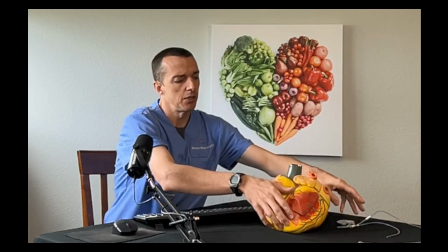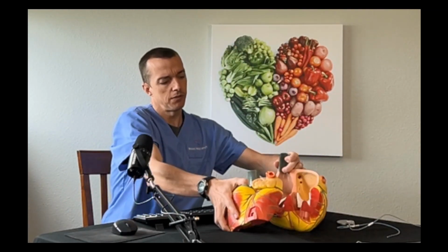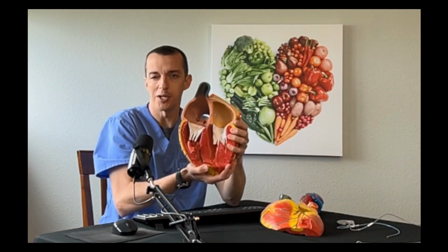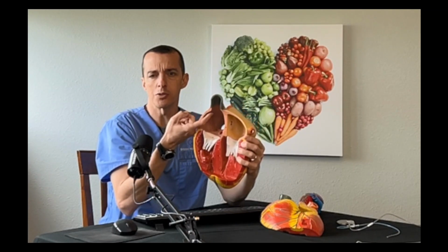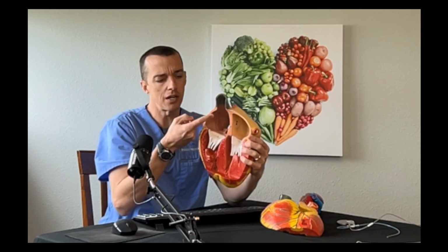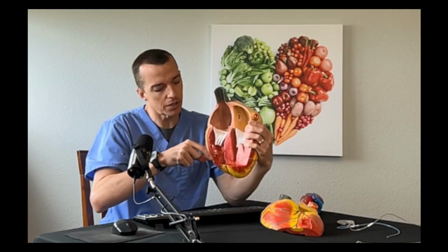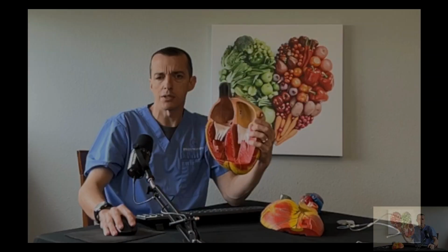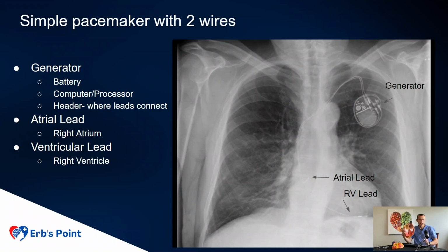Again, just to use it a little slightly different for some people, if you need to visualize it this way. Here is a gigantic heart, but we'll go with it here. And so this is your right atrium, and so you'll have a wire kind of stuck in there. And then this dual chamber pacemaker, you'll have a wire stuck down here in the right ventricle of your heart. So I'm going to go back to our x-ray here. And so we've got a wire J'd up right up here in the right atrium, and then we've got a wire down here in the right ventricle. Okay? So that's what's happened to you. Hopefully that makes sense. Again, we can cover that more in detail later.